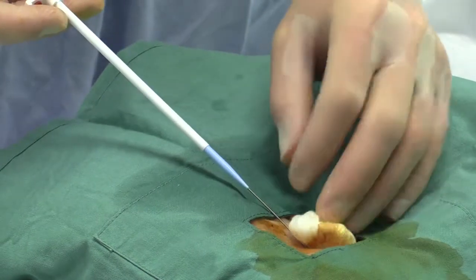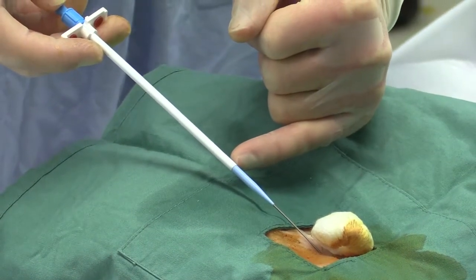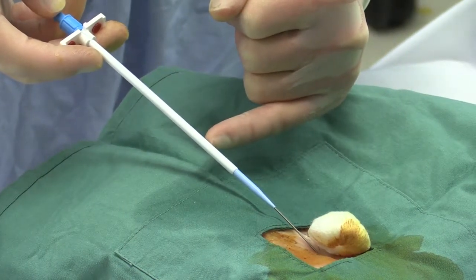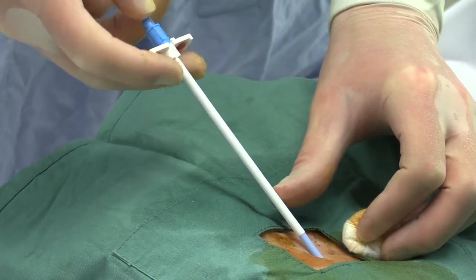It's important at this point to notice the distance from the tip of the radial dilator to the origin of the sheath, and it's important that this entire part of the catheter plus some of the peel away sheath is well inserted into the peritoneal cavity along the line of the guide wire towards the tip of the coccyx.